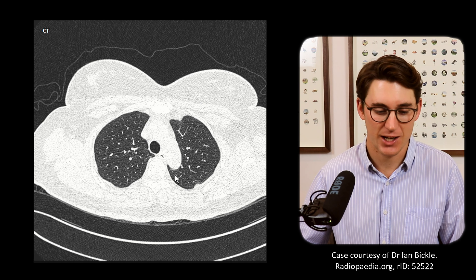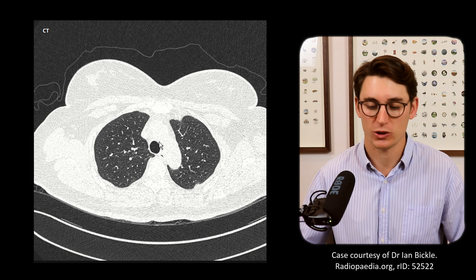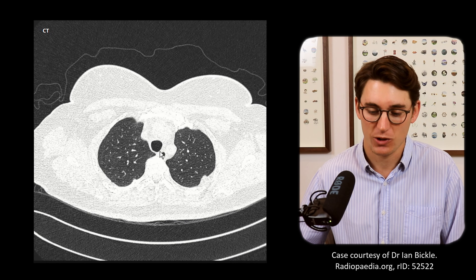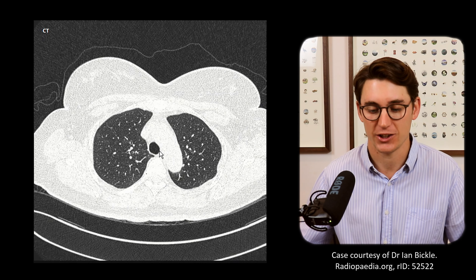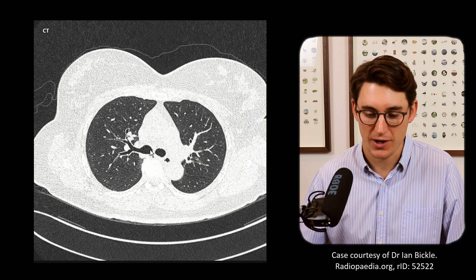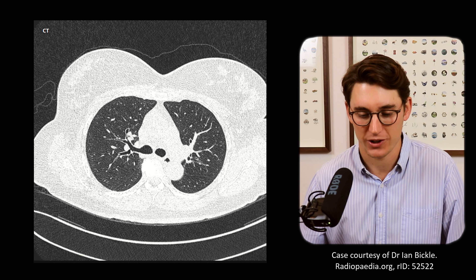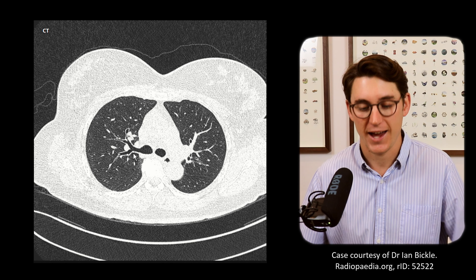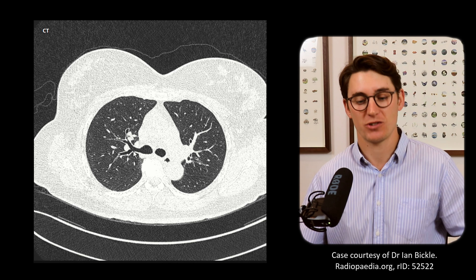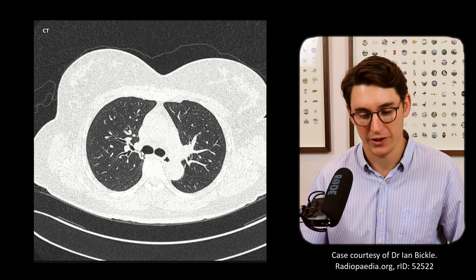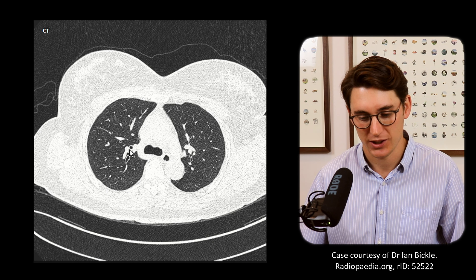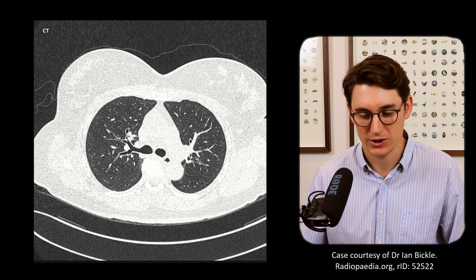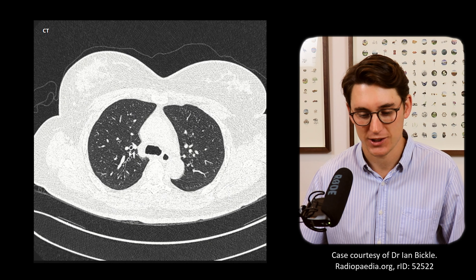On the axial CT scan in lung windows, we start at the superior portion where we can see a single trachea with the esophagus just posterior. We follow the trachea down to the carina to find our right main bronchus, then our right upper lobe bronchus. Here we can clearly see the anterior and posterior segments coming off, and scrolling superiorly reveals the apical segment — apical, anterior, and posterior all accounted for.